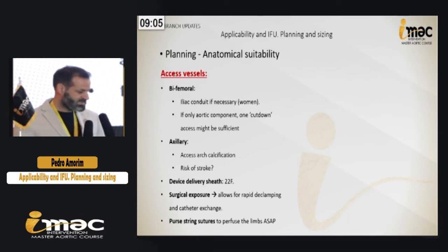We always, as I said, like to have a surgical exposure. It allows us a rapid declamping and a faster change of catheters. The purse strings allow us to perfuse the limbs as soon as possible and not to lose the access to the artery.